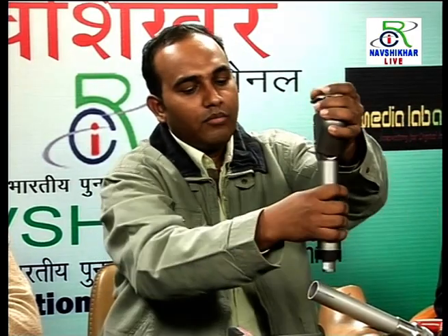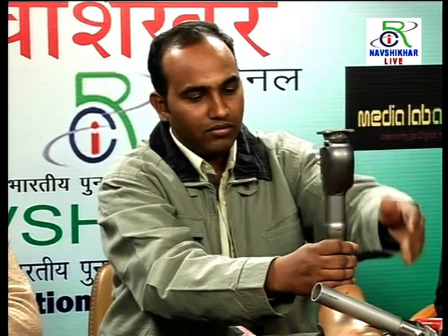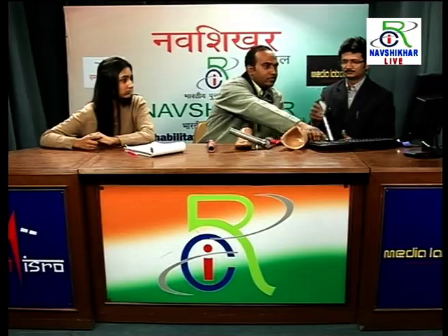So when the patient walks, it will be a jerky movement. That kind of knee joint is cheaper. So patients who can adjust to that jerky movement can go for that. But those who want better walking can go for a pneumatic or hydraulic system. So these are the different kinds of knee joints and their internal mechanisms, as you see.